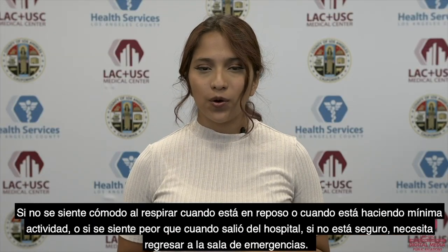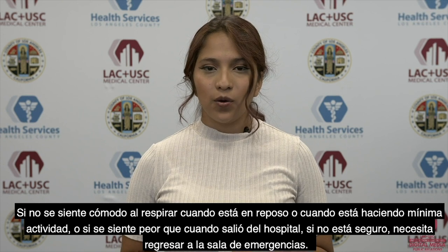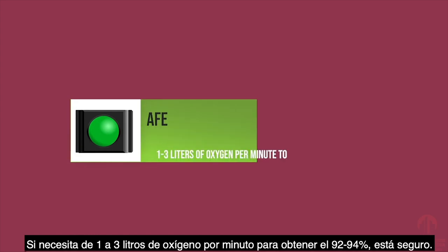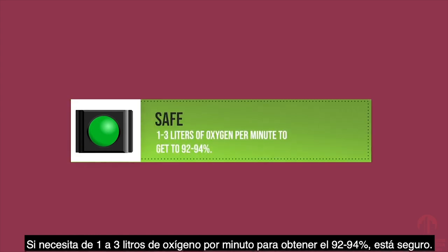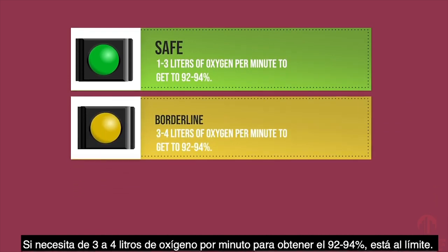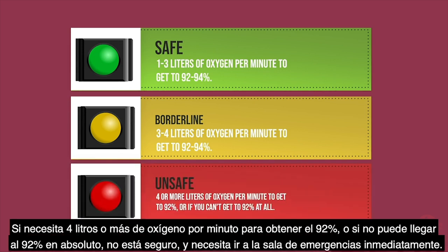If you don't feel comfortable breathing at rest or with minimal activity, or if you are feeling worse than when you left the hospital, you are unsafe and you need to return to the emergency department. Even if you feel comfortable, your numbers still have to be okay. If you need one to three liters of oxygen per minute to get 92 to 94%, you are safe. If you need three to four liters per minute to get to 92 to 94%, you are borderline. If you need four or more liters per minute to get to 92%, or if you can't get to 92% at all, you are unsafe — go to the emergency department right away.